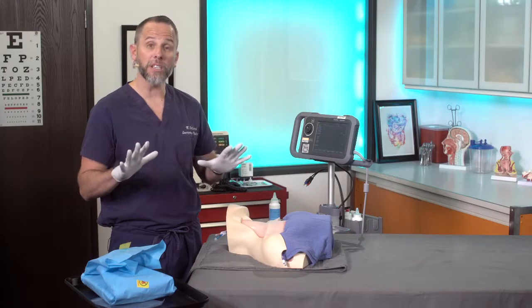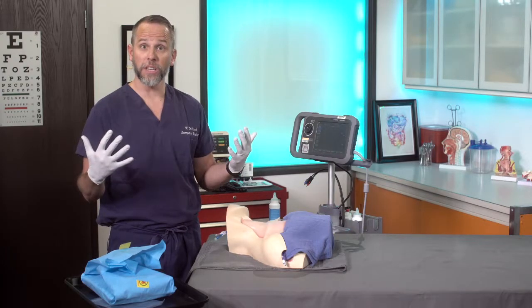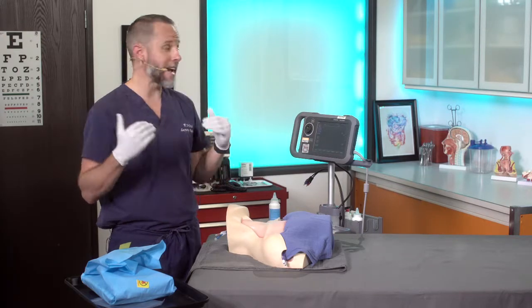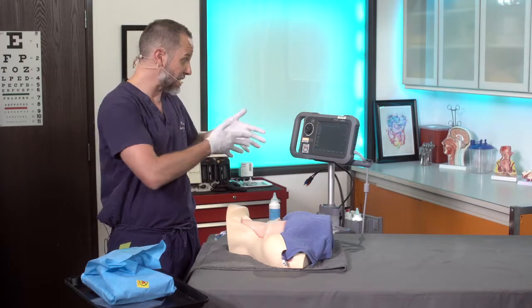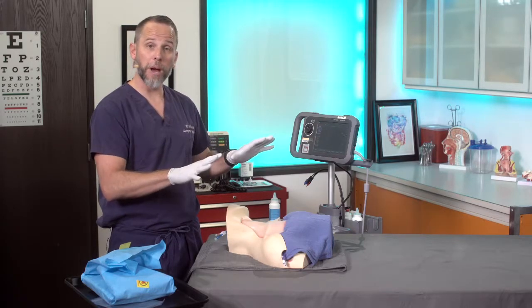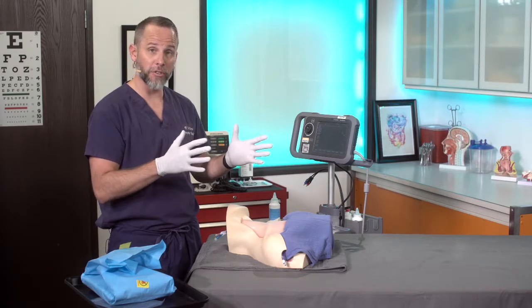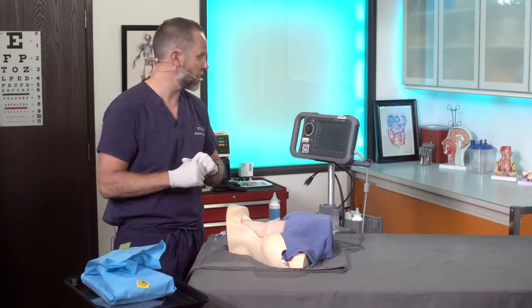I want to point out that this is a sterile procedure. Classically, if I was doing this in the ER, I'd be wearing a head bonnet, a mask, sterile gloves, and a gown. Because we're going to be using ultrasound, I would be using a sterile sleeve for my ultrasound guidance. You're going to prep and drape the patient as if it's a completely sterile procedure. We're not going to do that in this video just to make it easier for you to see what's going on, but all central lines are always a sterile procedure.